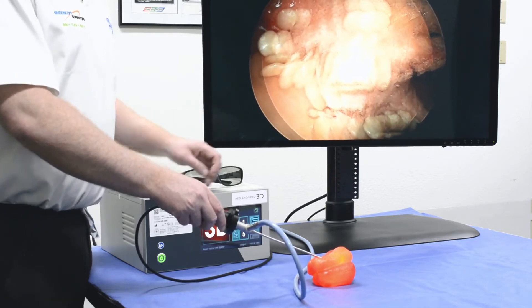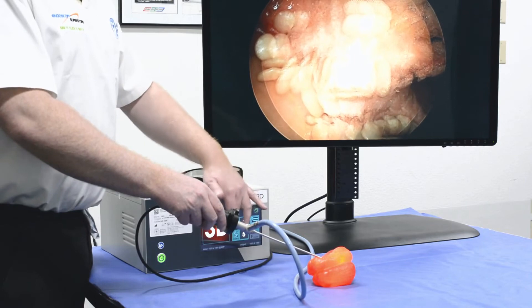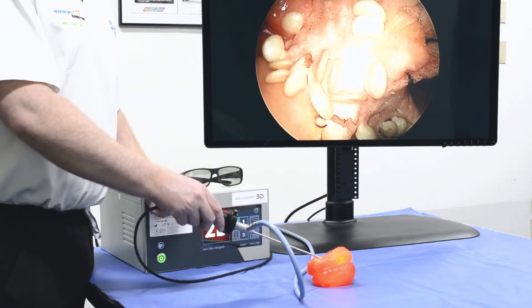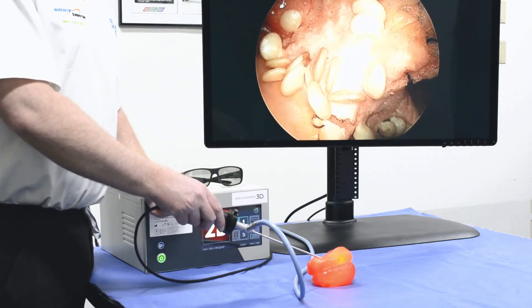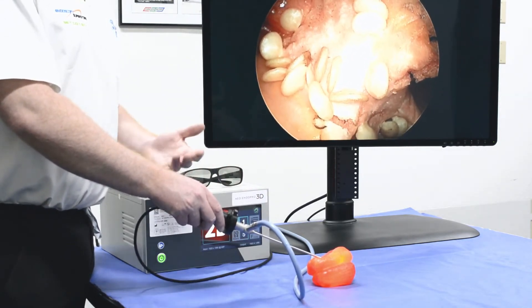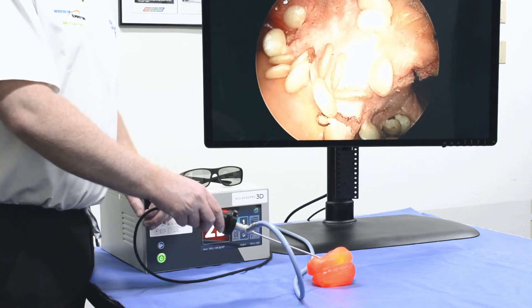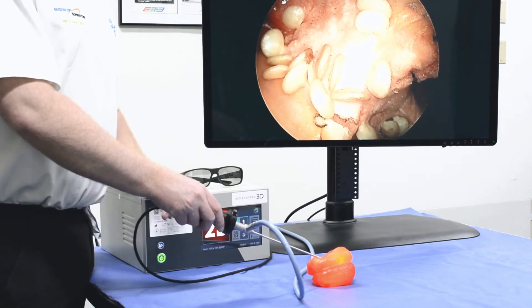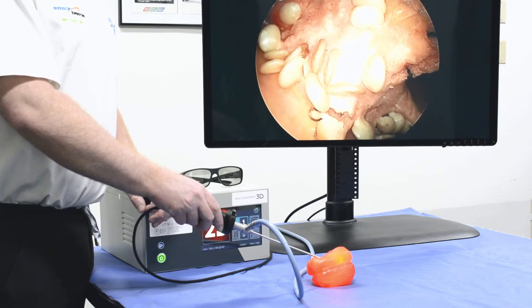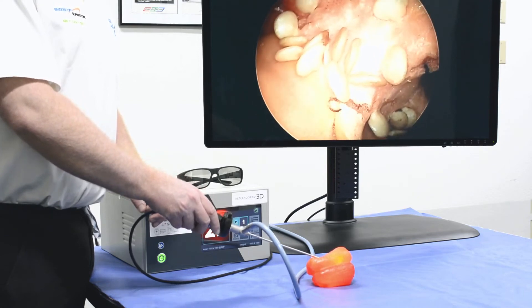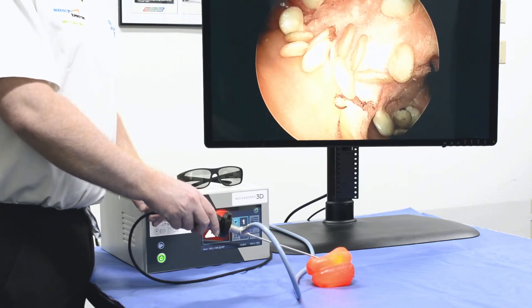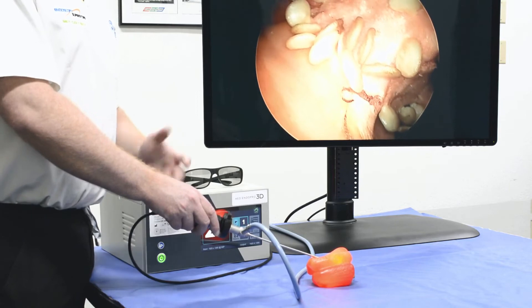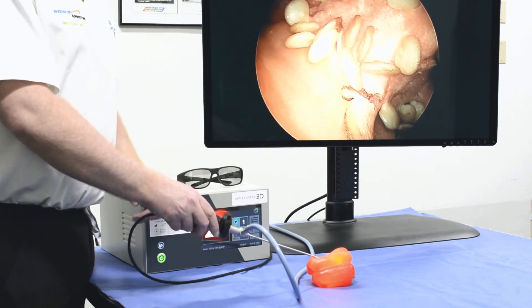The ability to perceive depth provides great value to physicians, especially when understanding the orientation of the scope in the anatomy, learning new difficult procedures, or getting into situations where you're very close to certain nerves or vessels that you would want to avoid damaging.